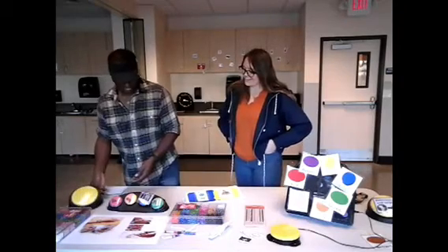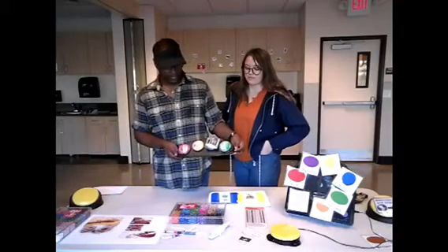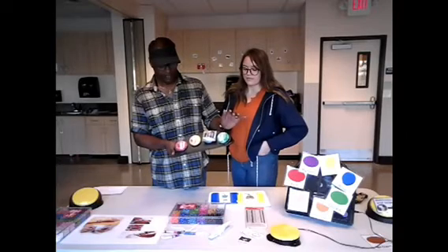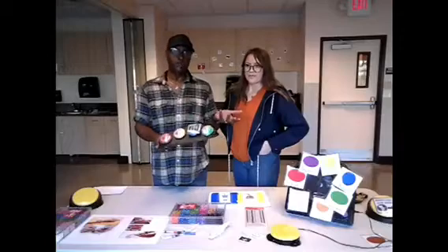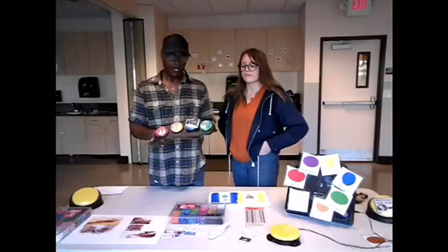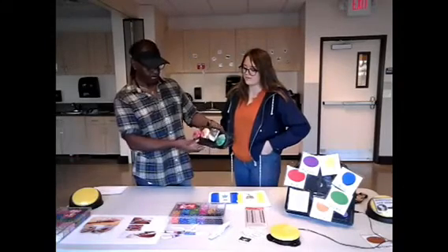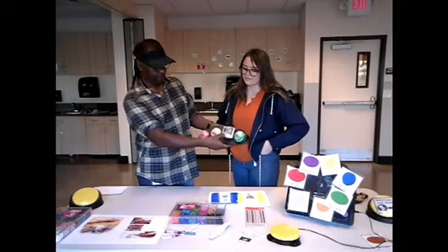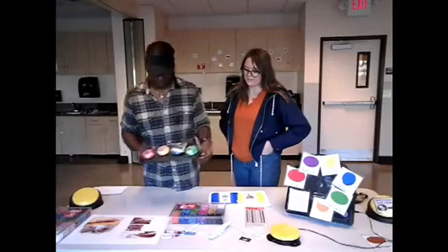And then next we have a multi-device. On this one particularly, we can set it up for several different things. We can get a yes response. Yes, please. We can get a no response. No, thank you. Usually when I set up activities, I like to address the consumers with a question, and they're going to respond to give you a yes or no. And then there's also a help button here. I need help, please. And we have, I need to use the restroom. That's just a multi-device set up for the consumers.